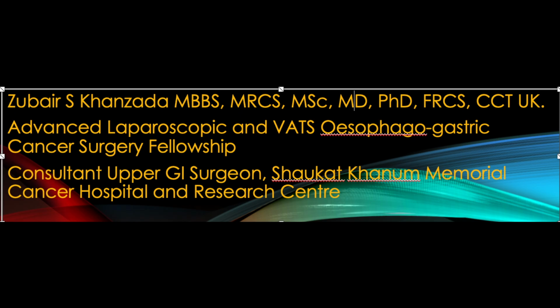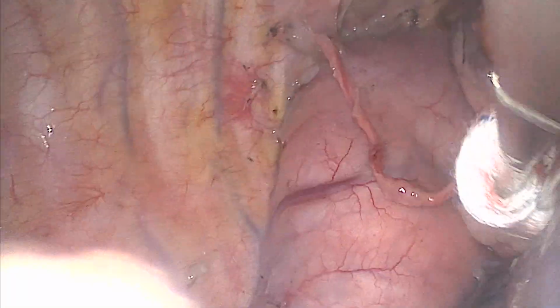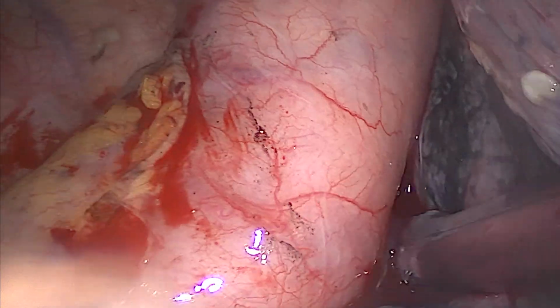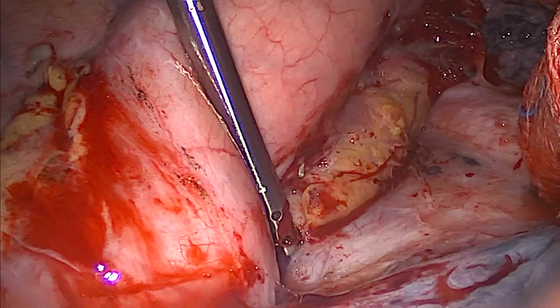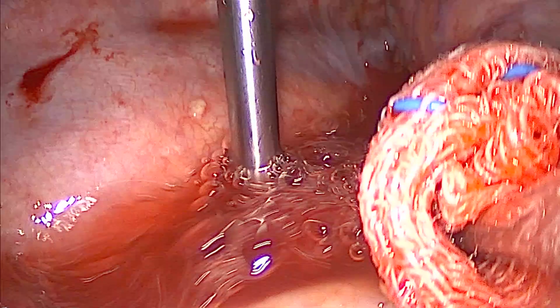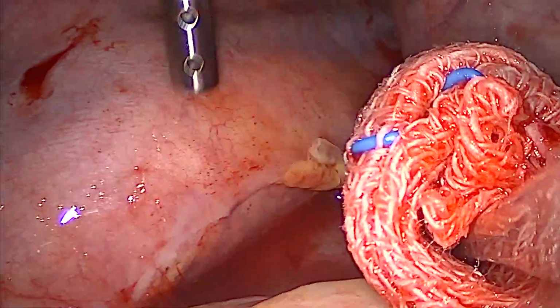This time I'm going to share a complication which is unfortunately a thoracic duct injury post VATS two-stage oesophagectomy. Once we started our VATS, we looked at the conduit, which looked fairly healthy in this case. Then we retracted the lung and the conduit anteriorly, and started carefully looking for the thoracic duct in order to ligate it at the base of the right thoracic cavity.